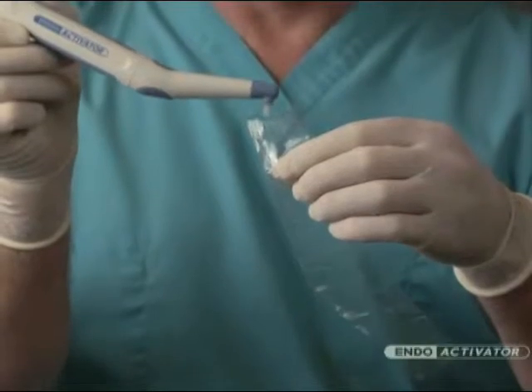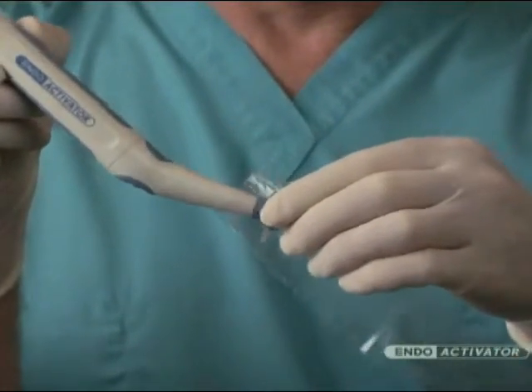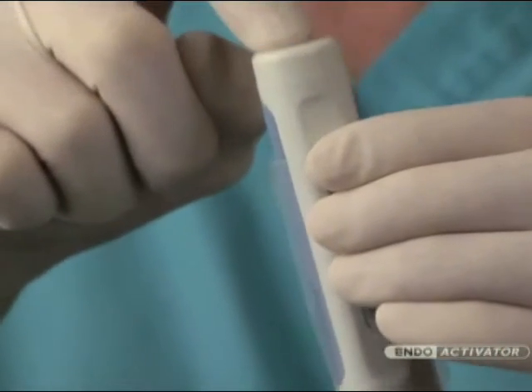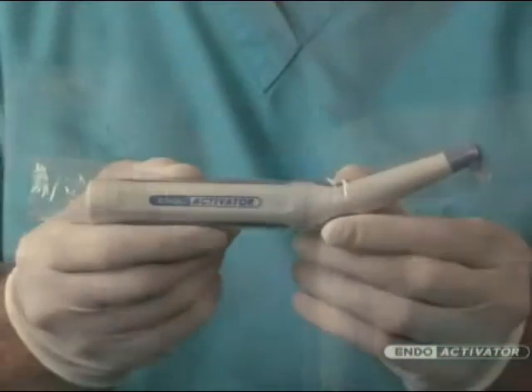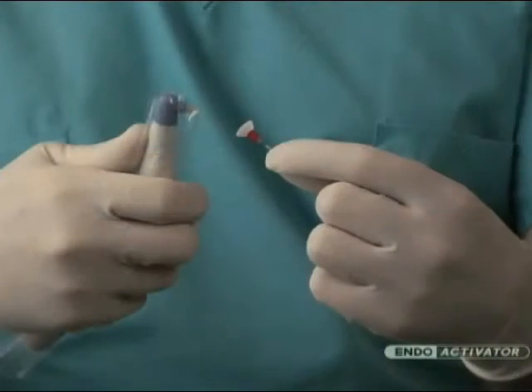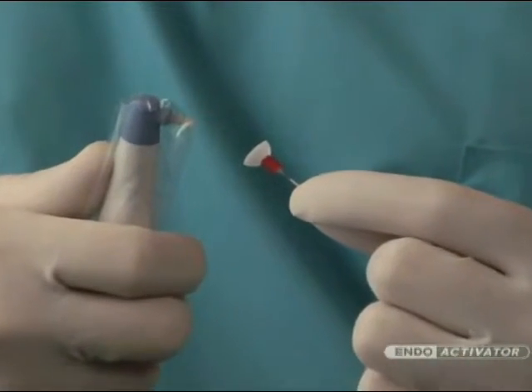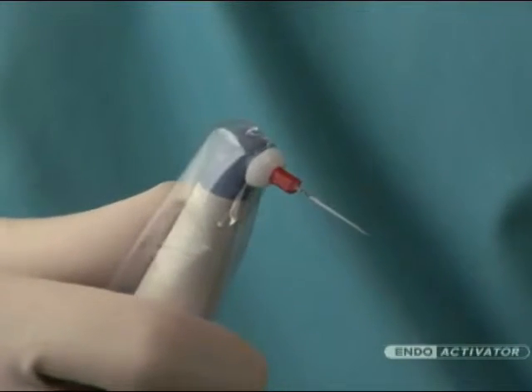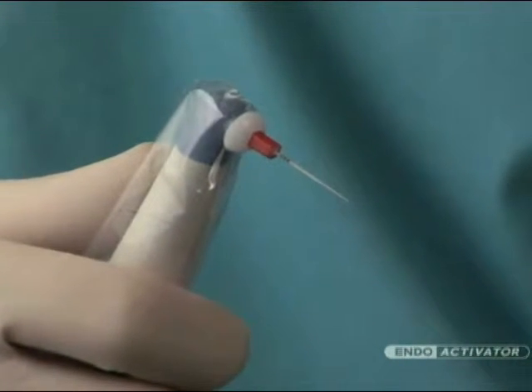Now that you are familiar with the EndoActivator system, let's look at the clinical guidelines for infection control. Place the barrier sleeve over the driver to protect the entire handpiece. Importantly, attach the activator over the barrier-protected driver. The activator should snap on firmly, promoting a secure connection with the handpiece.